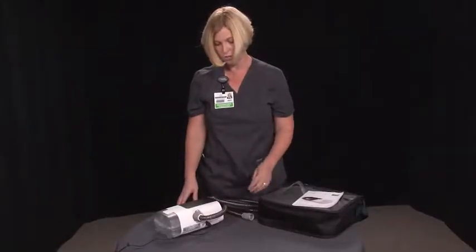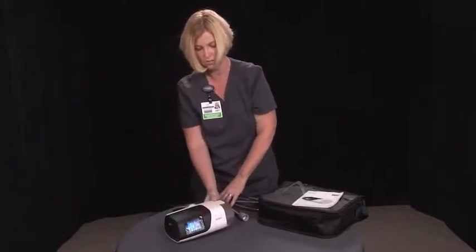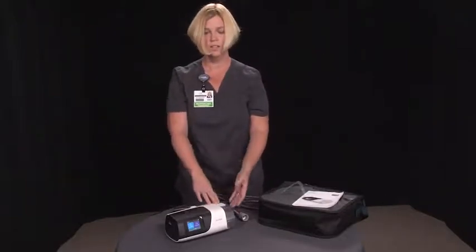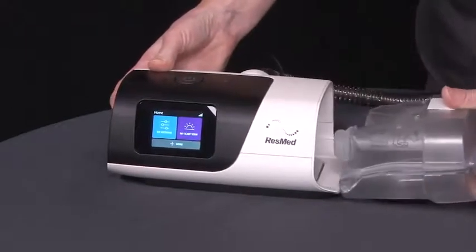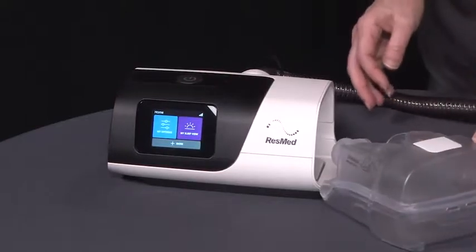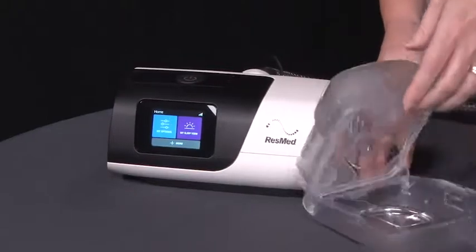To get started with your therapy, I'm going to turn this machine around. The first thing you're going to want to do is to remove the water chamber. To remove it, you just squeeze and pull. When you remove the water chamber, you're going to lift up on this outside edge and lift up on the lid.